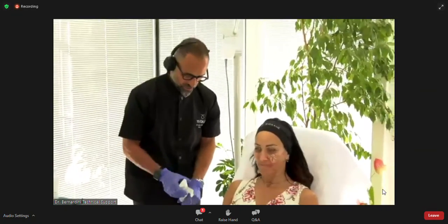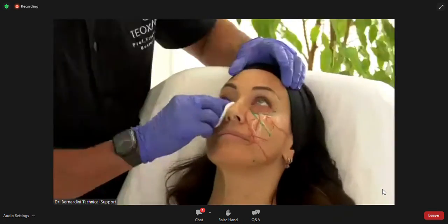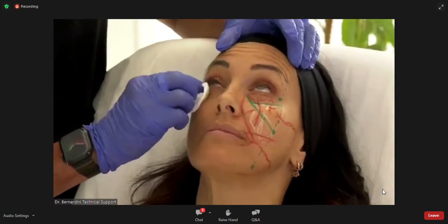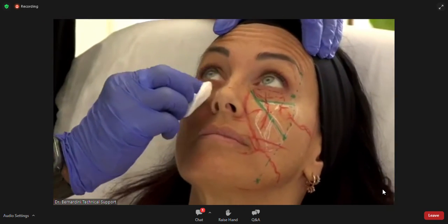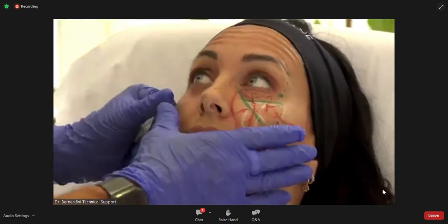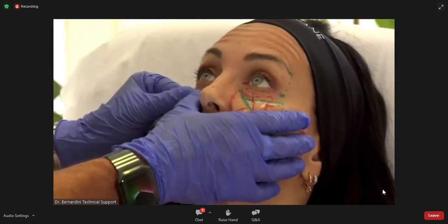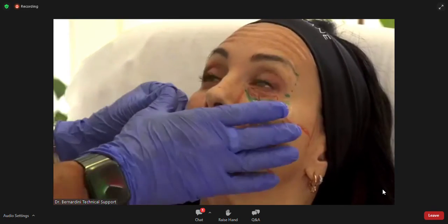Okay, so at this point I clean up what I have drawn before. I only leave my entry point highlighted, the G point. I start looking at things, and I promise you, I will show you the before and after, comparing one side to the other.